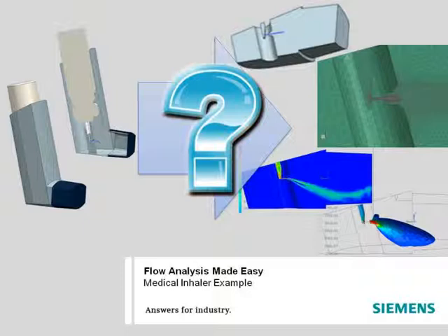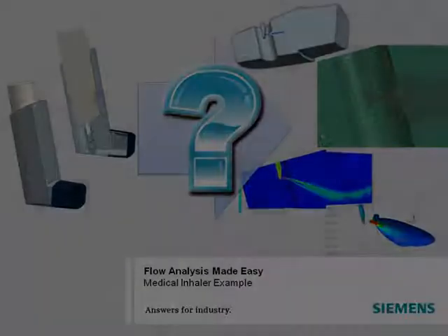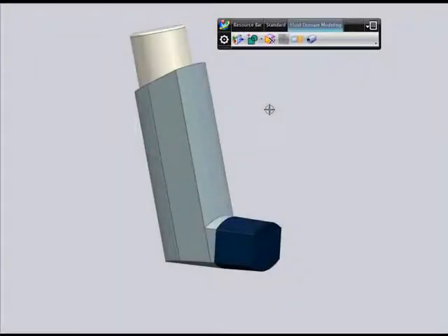NX makes it easy to conduct flow analysis. In this example, you'll see a simple workflow for setting up a steady-state flow analysis for a medical inhaler, from preparing geometry to meshing and defining loads and boundary conditions, and finally to examining results.